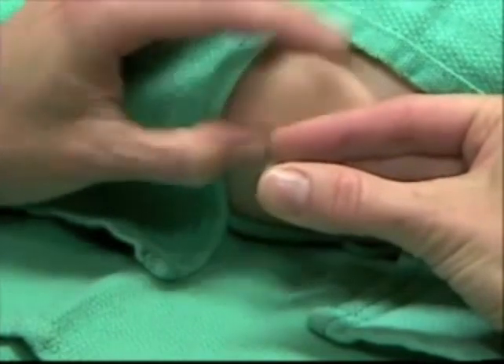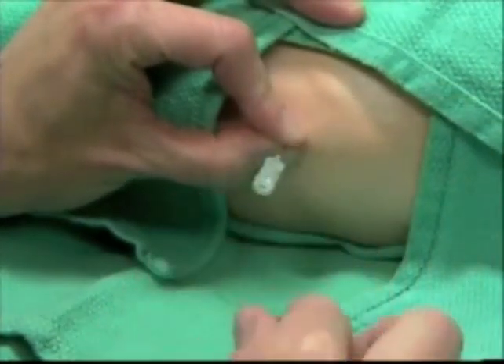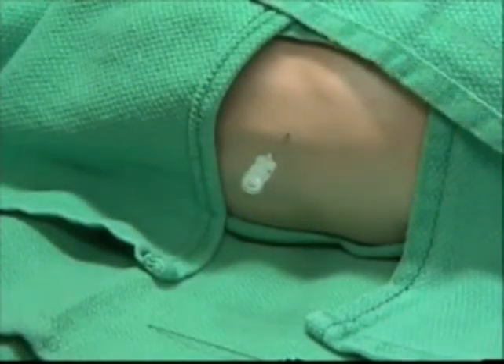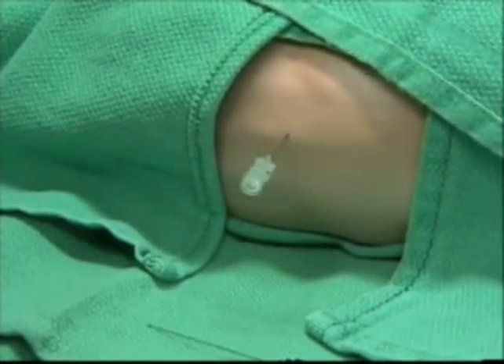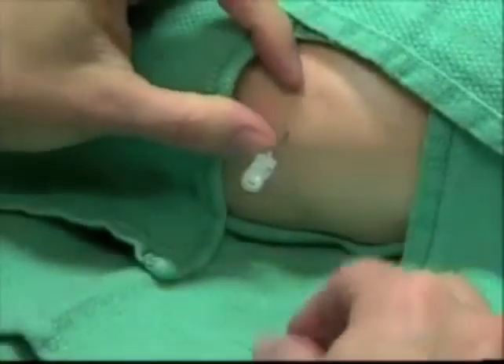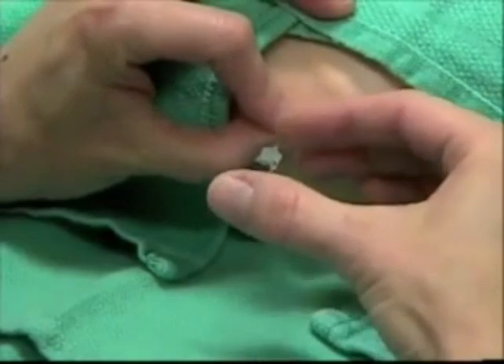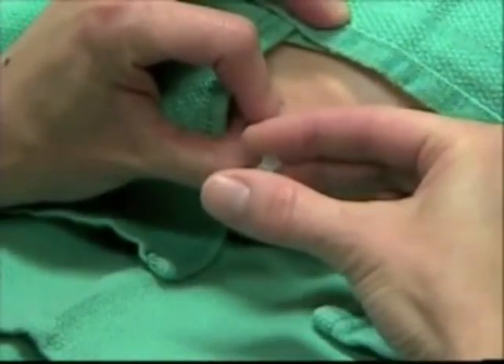As you move the needle in, you may or may not feel a change in resistance, often called a pop. If you're not sure if there has been a change in resistance, periodically take the stylet out and see if there is CSF flow. If you cannot get flow, put the stylet back in and go a bit further. Recheck periodically.